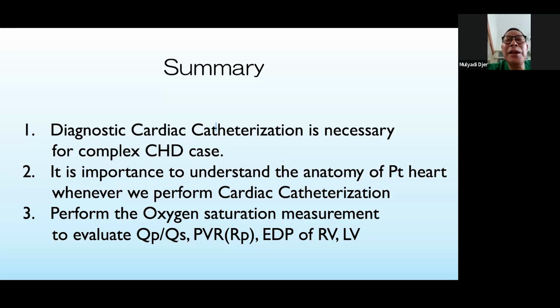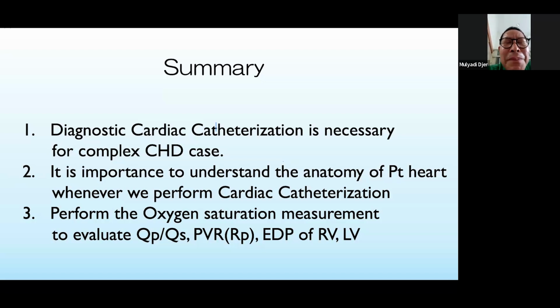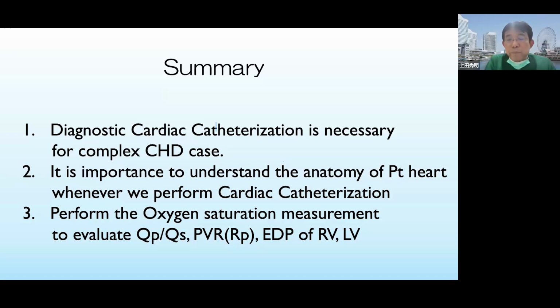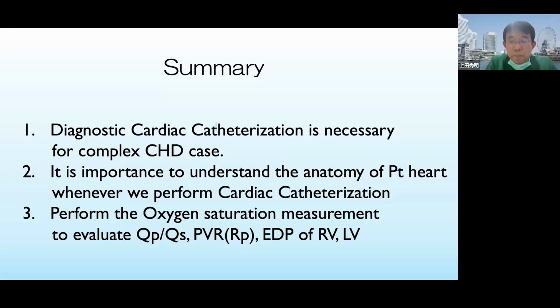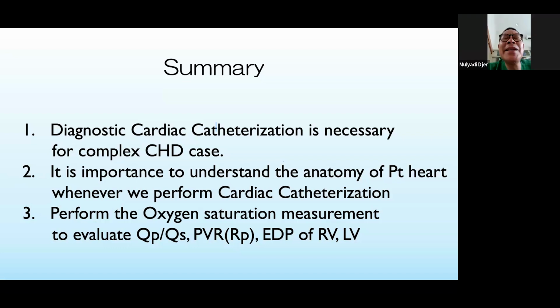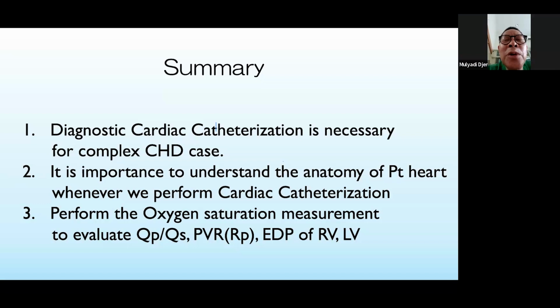I have one question for you about using the oxygen test. Sometimes in complex congenital disease, for example in truncus, in pulmonary atresia, how is the application of the oxygen test in that complex congenital disease? Do we need to do the oxygen test in complex congenital disease?